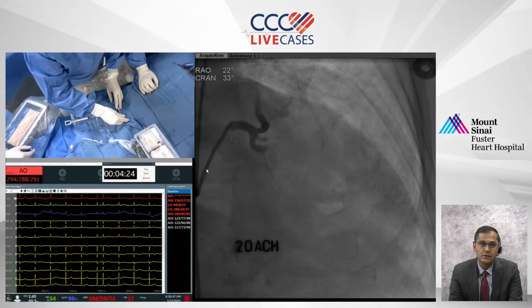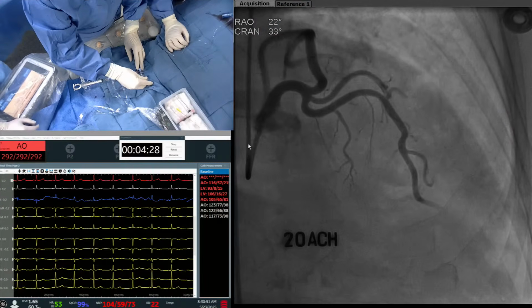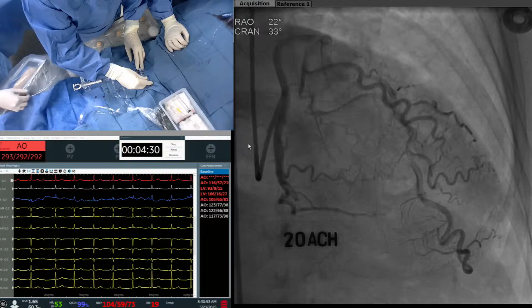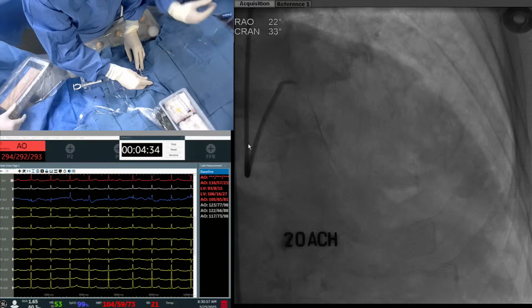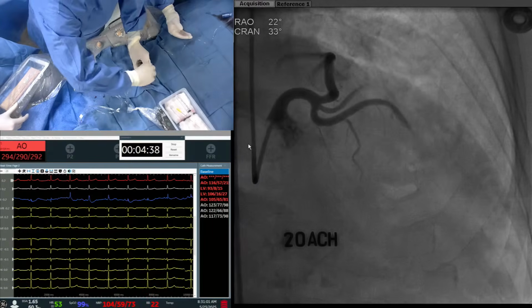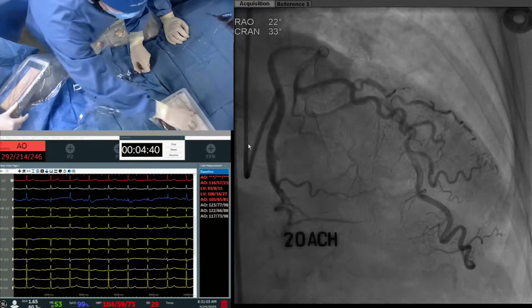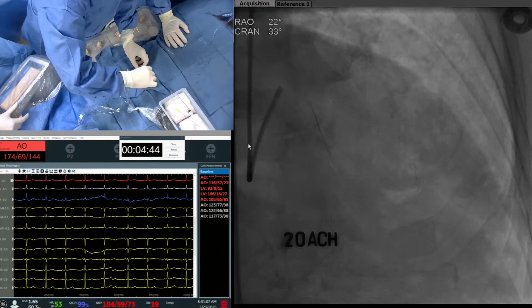The other thing, sometimes in the diagnostic, the fellow may actually induce a severe spasm in the RCA, and you need to give nitroglycerin. So you do your microvascular testing first. You wait at least 15 to 20, 30 minutes to do your acetylcholine. So don't get desperate if you have a bad spasm induced by the catheter.